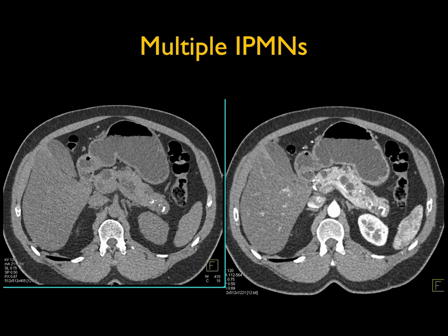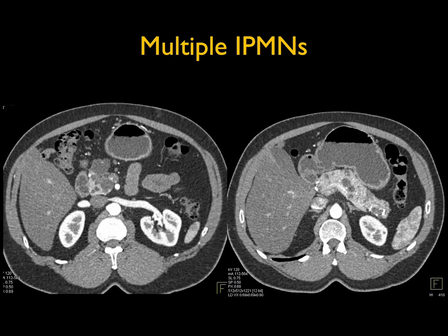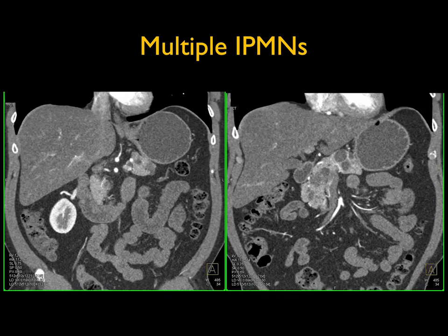Here's a patient with multiple IPMNs — the one by the tail has calcifications, but there are multiple IPMNs present. This is a challenge in terms of management: we worry about IPMNs having malignancy. Do you do a distal pancreatectomy or a total pancreatectomy? A total pancreatectomy would cure the patient, but patients develop diabetes, often have significant post-op problems, and their lifespan is shortened. We tend to look at the largest lesion as the one of most concern, but you need to look at all lesions carefully using CT and MR, with careful short-term follow-up.